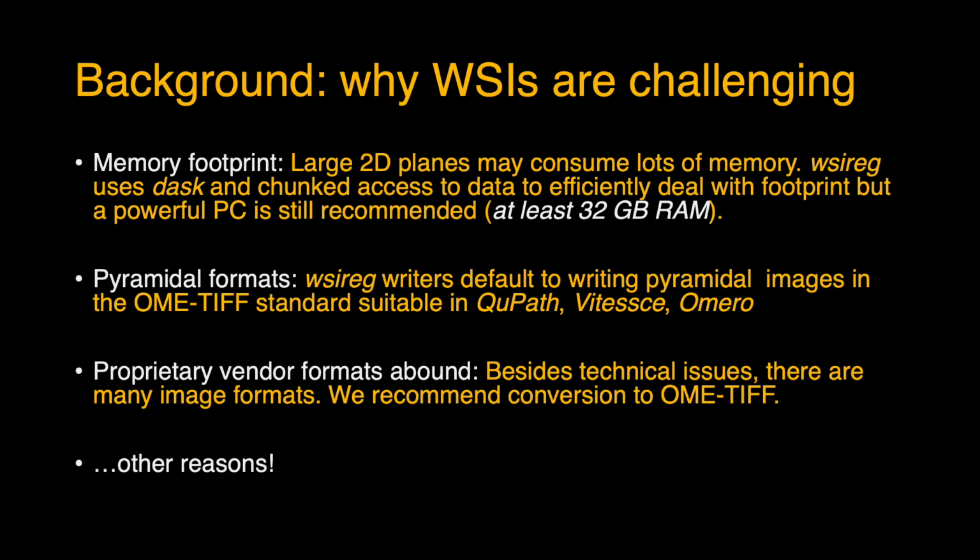So whole slide reg, wsireg, deals with this by using Dask and attempts to always have chunk, tile level access to the data to efficiently deal with this footprint. But that said, a powerful PC is still recommended for a lot of the operations. So I'd say RAM is the real limiting factor here. So at least 32 gigabytes RAM is recommended.